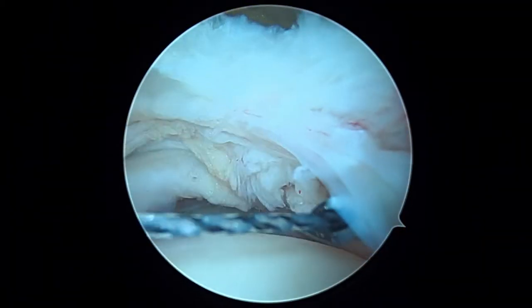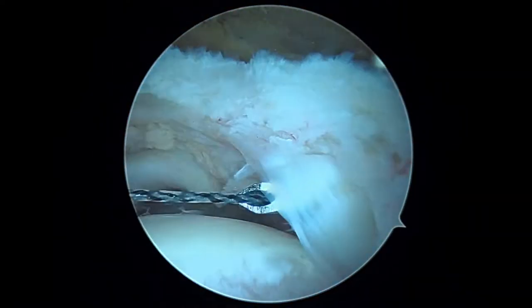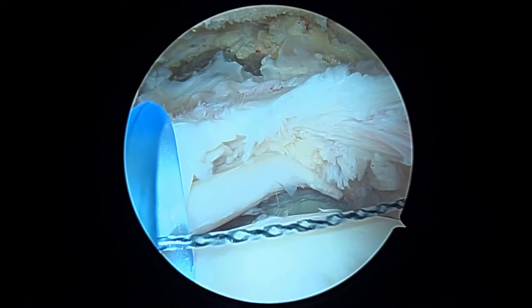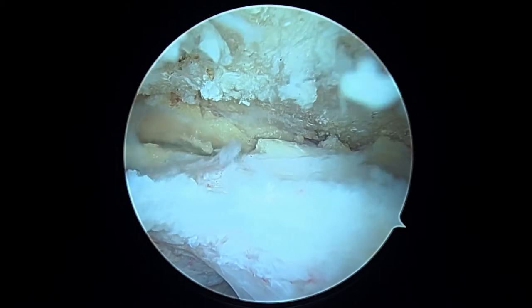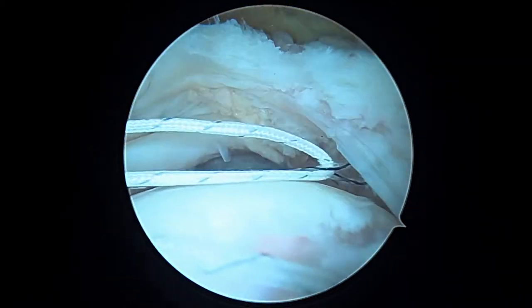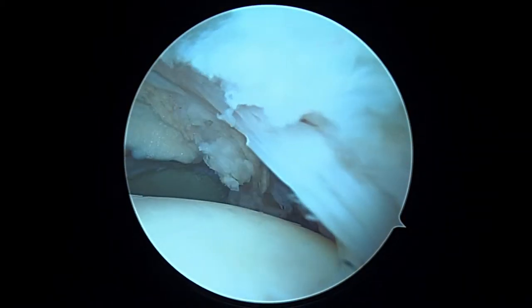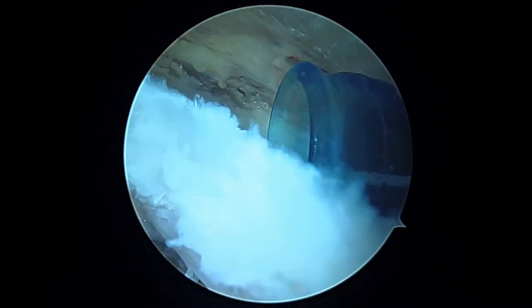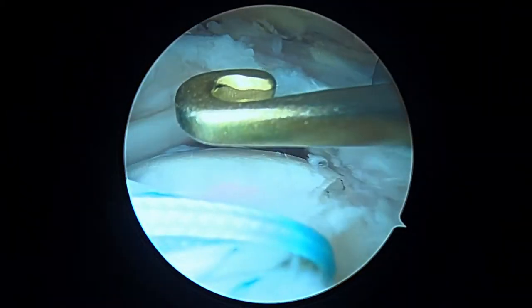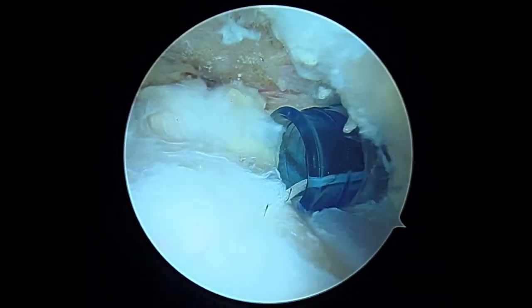We'll feed the relay and retrieve it, then outside your shoulder we're going to load it — there's a little hole in that black wire and we're going to load it with a suture, put about one inch through the hole. Watch carefully — we pull it back just an inch, following it all the way down. As we pull back you can see how it brings that black and white suture with it. We'll pull all the way tight, and now you can see all that suture going underneath the tendons. We'll reach in and get the partner suture and tie this knot.